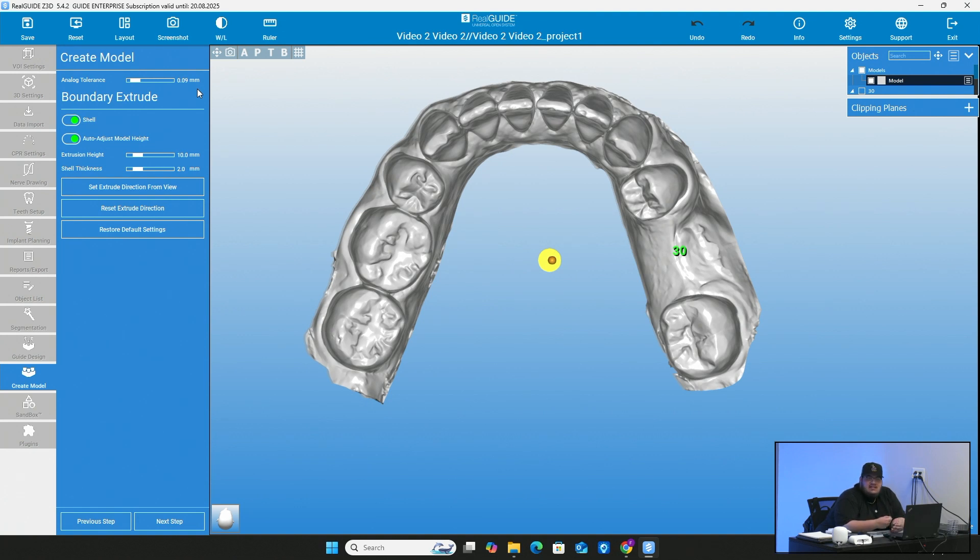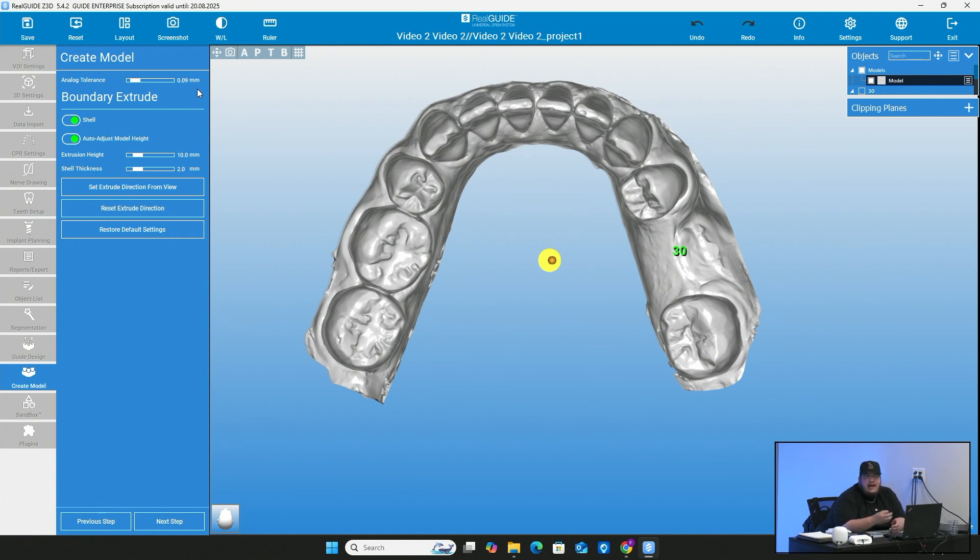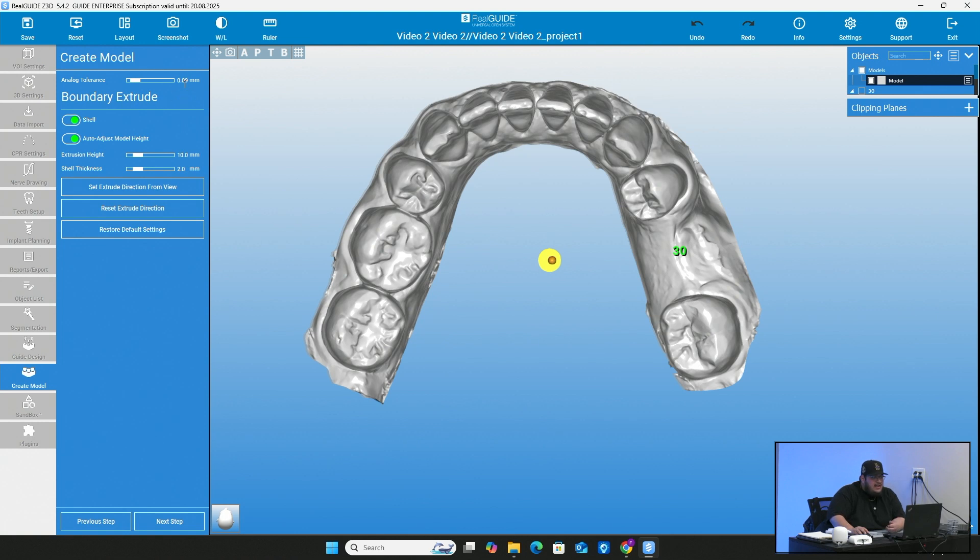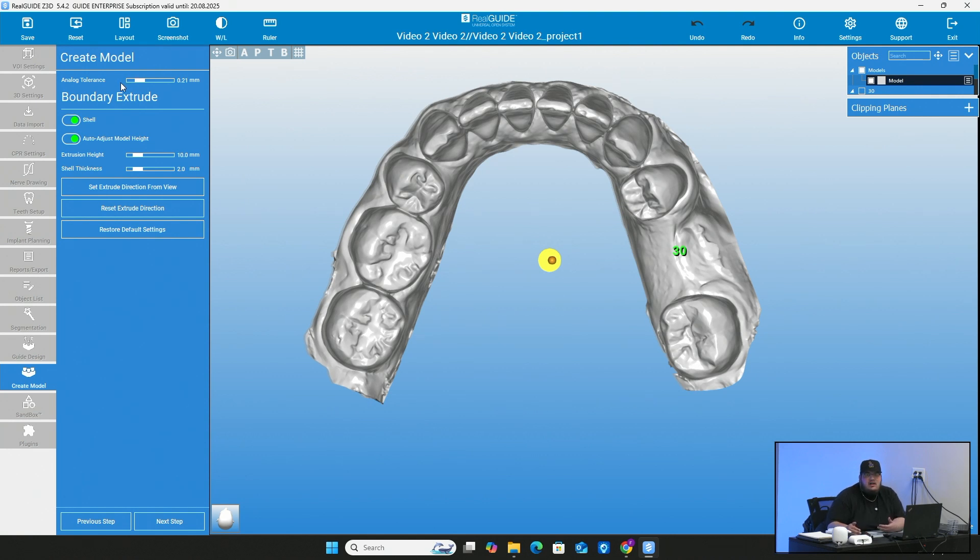So usually I go from anywhere from 0.05 to 0.10. Anywhere in between there, it's not going to be so loose that the analog is going to move around or anything like that. But it's also not going to be so tight that the analog can't just drop right in without having to use force. You don't want to have to sit there with a little bit of a tool to hammer it in. You can crack the model.